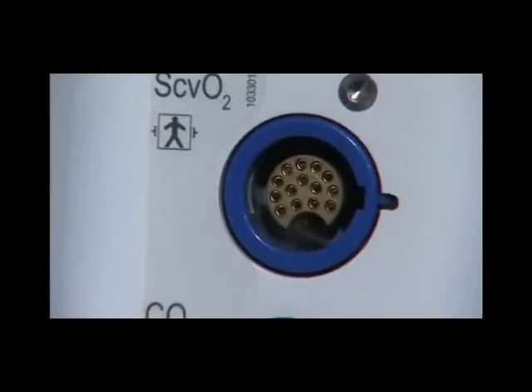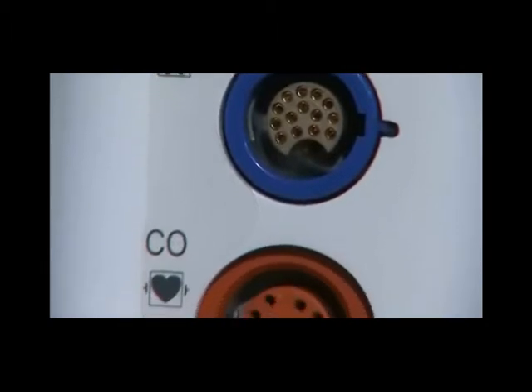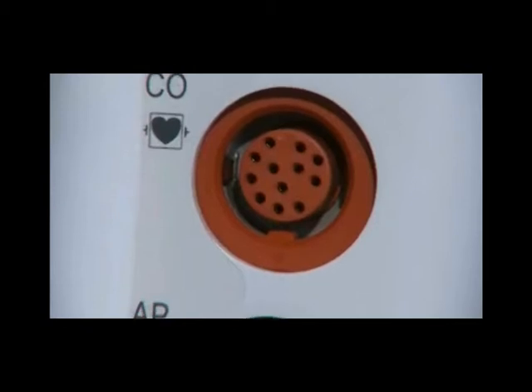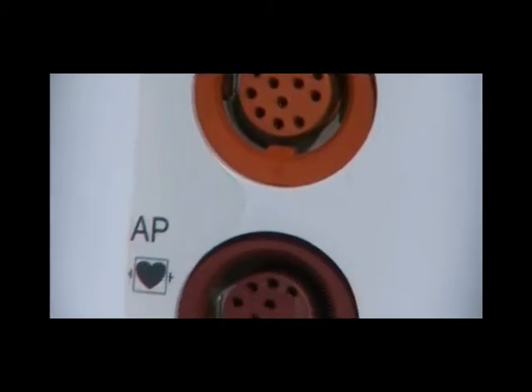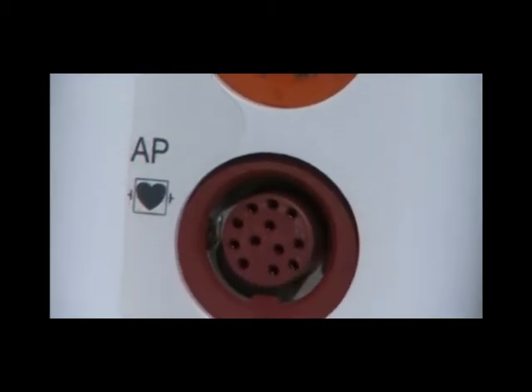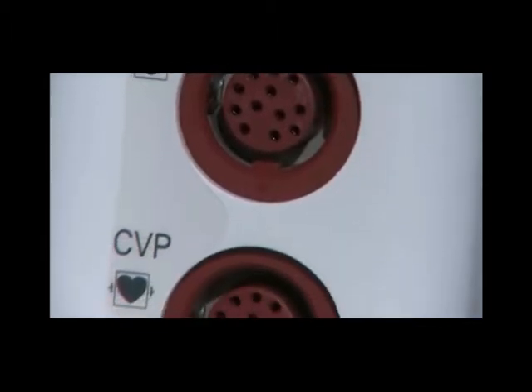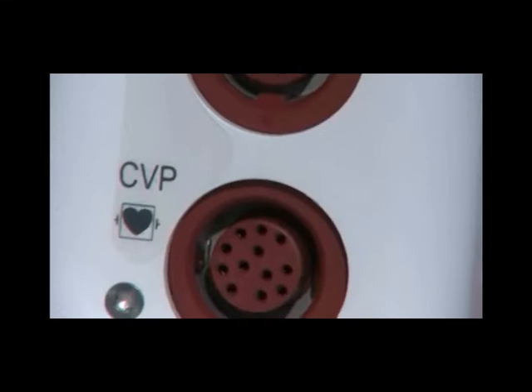The cable sockets are color-coded. At the top is the blue socket for central venous saturation measurement, that is, for the optical module of the CVOX probe. Below it is the orange socket for cardiac output measurement, that's for the temperature cable. This is followed by the arterial pressure socket in red. A further pressure measurement can be plugged in at the bottom, for example for CVP.